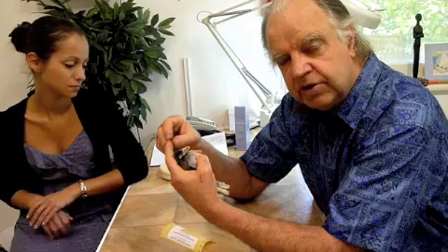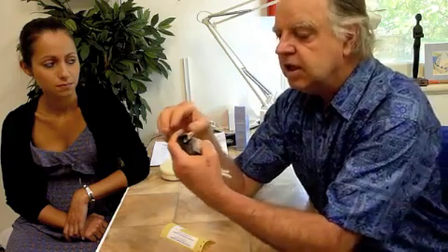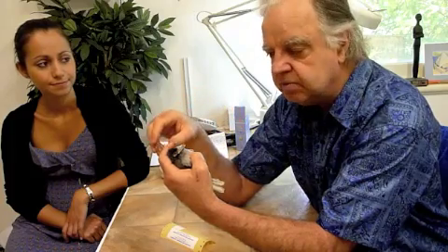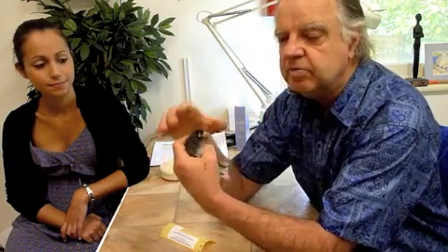I used a 23-gauge needle as my scalpel to do that. Then we tried putting four pins — two pins here and two pins here — using very fine 30-gauge needles, and then setting a little splint between them. But the splint wouldn't stay, and that didn't work.